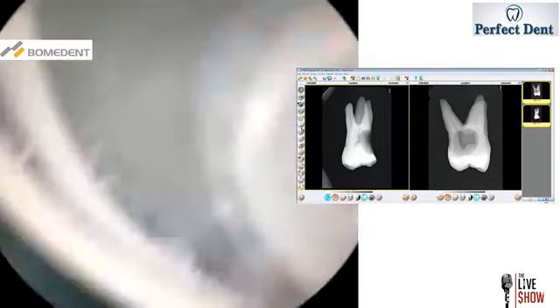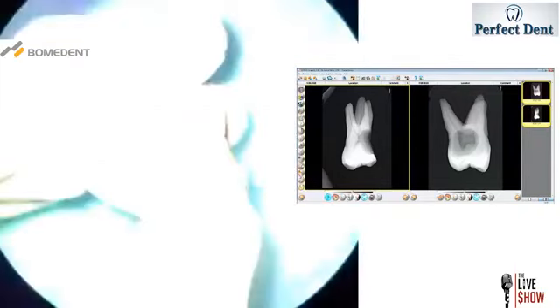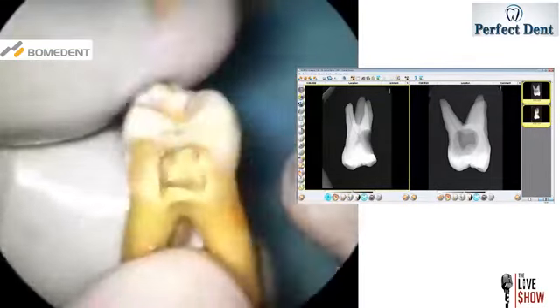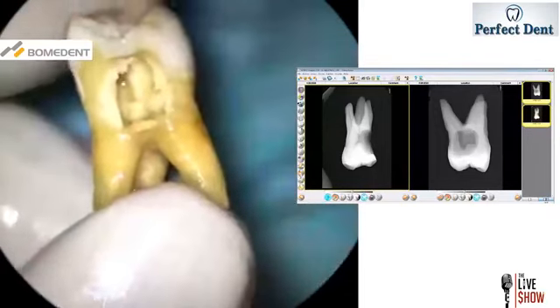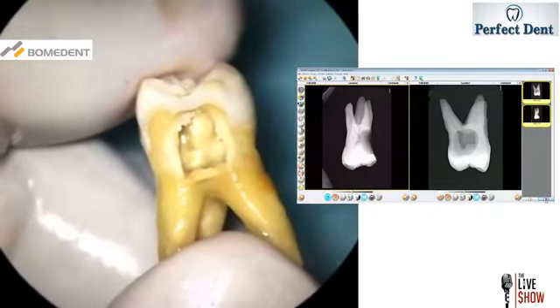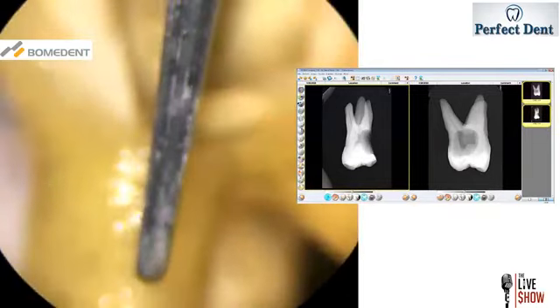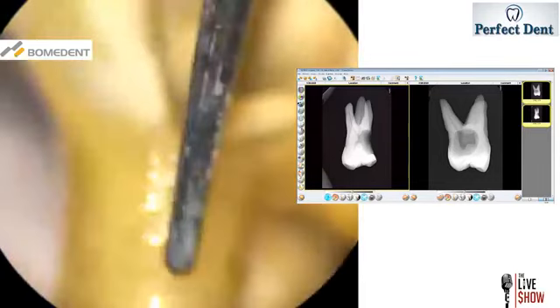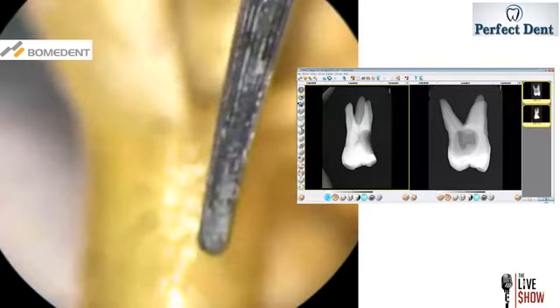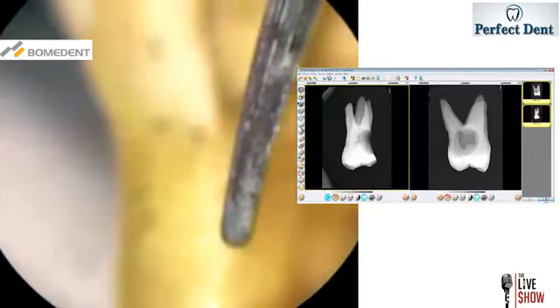Doctor, there is a question here saying, are you using a diamond-coated ultrasonic tip? That's a good question. The tip that you saw was not diamond coated. It has a micro mill tip. It has flutes. Can I have the ultrasonic? You can see this ultrasonic. I'm going to zoom in a little more. You can see it has flutes. These flutes are sharp and they vibrate and they cut. It's called a micro milled tip, and it's not diamond coated. It's not smooth.